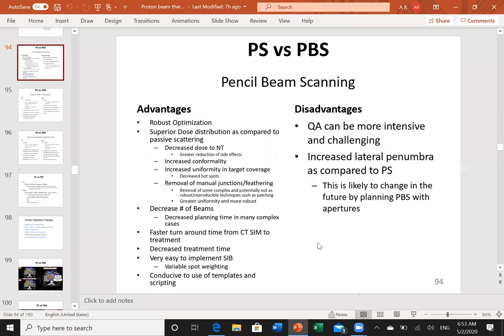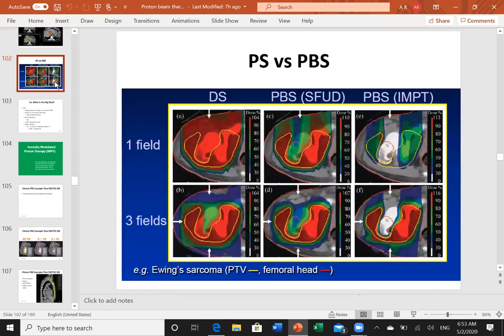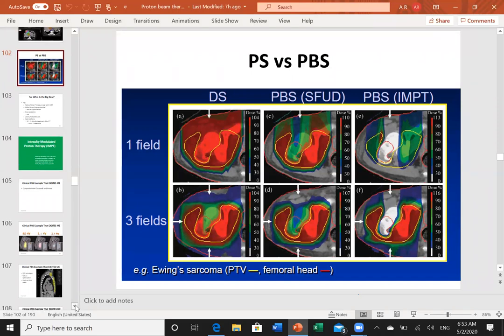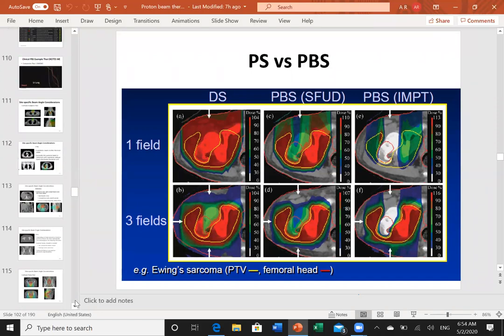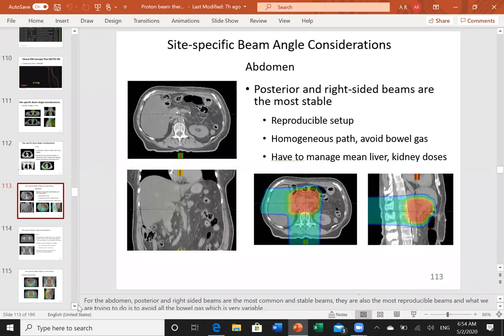I think in the last presentation, there was a presenter also talking about proton beam therapy, and one of the publications that he quoted in terms of toxicity, if proton therapy is compared to the conformal, and the conformal was IMRT, he was saying that for a cohort of patients with prostate cancer, the toxicity was compared between the conformal and the proton therapy. And what they found is that there's no significant difference in terms of toxicity to the normal tissue.